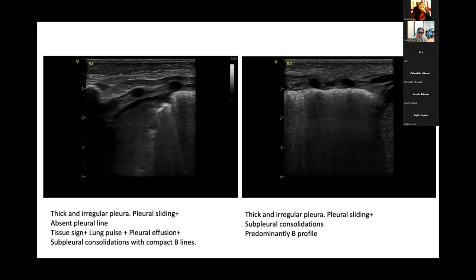Thank you for sharing. So which side was the pleural drain inserted antenatally? So antenatally on the right side. On the right side. Because it's interesting, the lungs are quite asymmetrical, aren't they? When it comes to the severity of the interstitial syndrome.